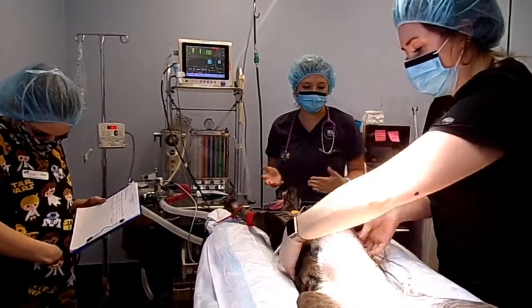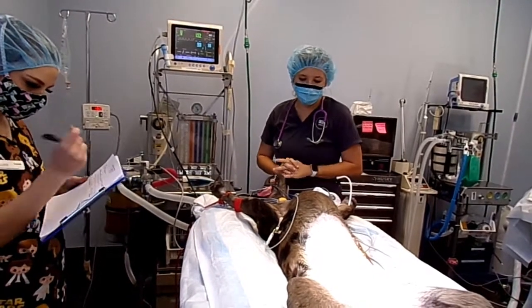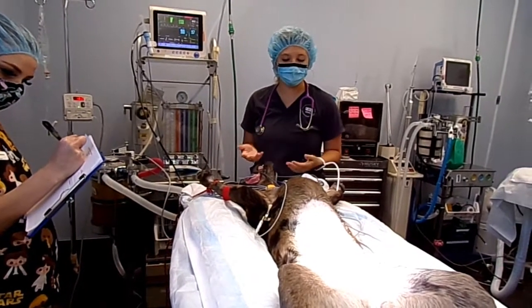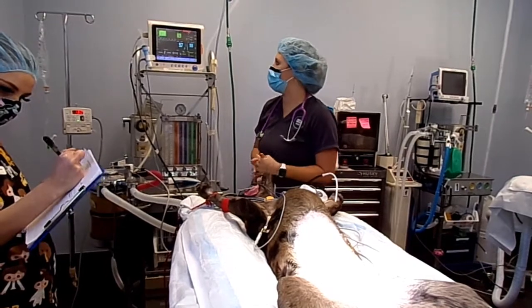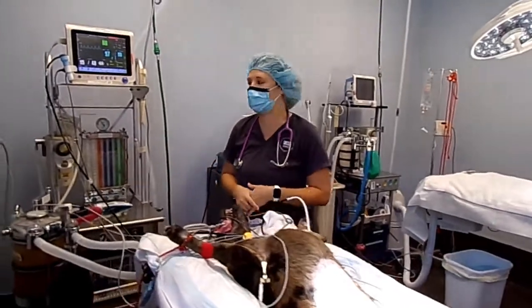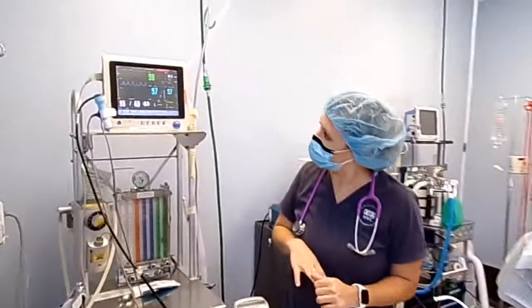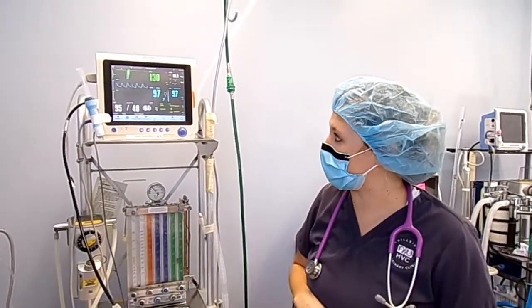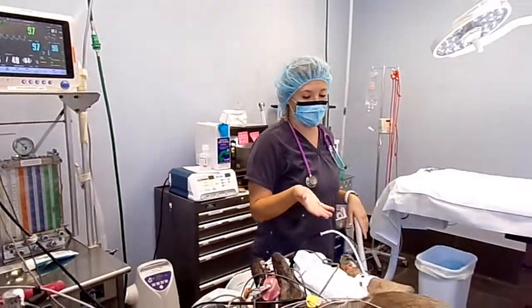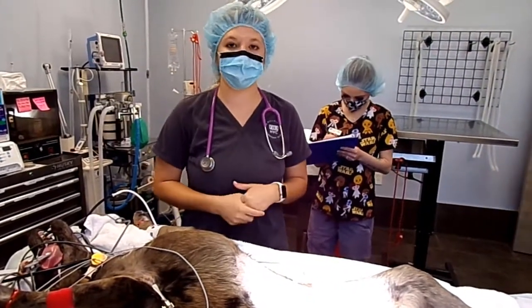Our job during surgery is to monitor and make sure our patient is doing well. Every five minutes we record on our anesthetic charts, but that doesn't mean you're only monitoring every five minutes — you're always watching everything. You never want to completely trust your machine, so always take a manual heart rate every now and then. Her vitals look pretty normal. We'll take a blood pressure again, and then Holly will do our final scrub before the surgeon comes in.